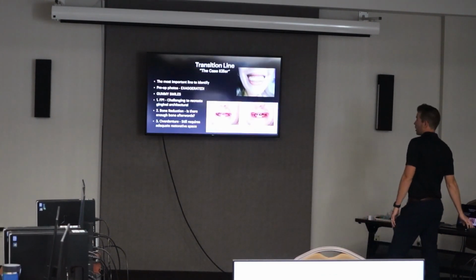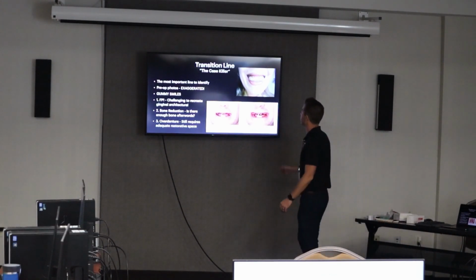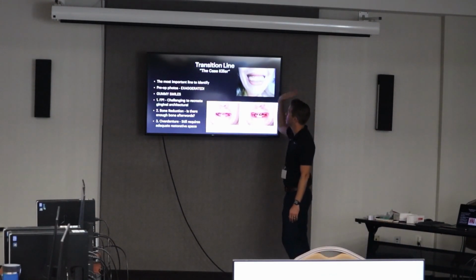So the transition line, we call it the case killer. So you don't end up with this. I mean, that's just ugly.